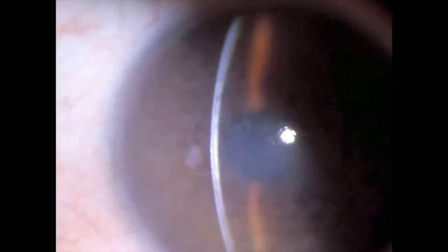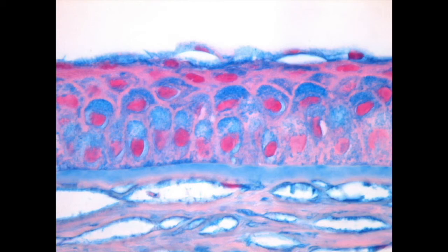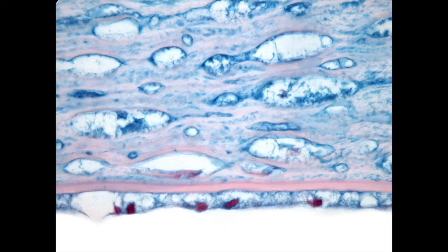Here's this clouded cornea. We can see with the slit lamp that the cornea does not look that thickened. Here's the histology showing the blue deposits in the epithelium and Bowman's membrane and the keratocytes. It's the colloidal iron stain, and again, more deposits in the keratocytes and the endothelial cells.